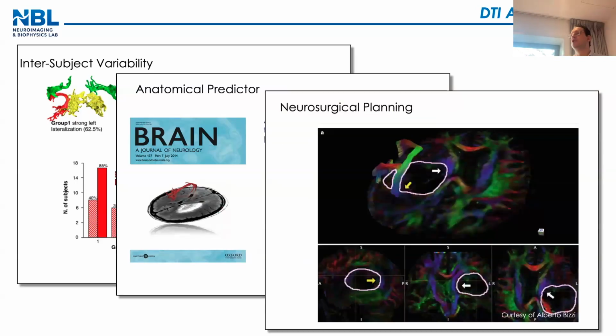But of course, the main clinical application of tractography is neurosurgical planning, because now we have a tool, as I said before, on a single subject, to see how the anatomy is different. I don't have to do an average. I can immediately see that the presence of a lesion in the insula displaces my corticospinal tract, my tractography is deformed, so the neurosurgeon immediately sees how to proceed. You say you're a neurosurgeon, right? So you might not be interested in exactly the cortical termination, but more in the segmentation of the tract.